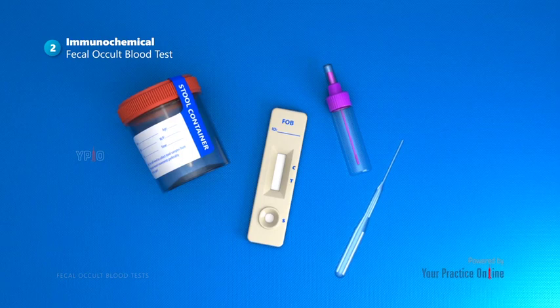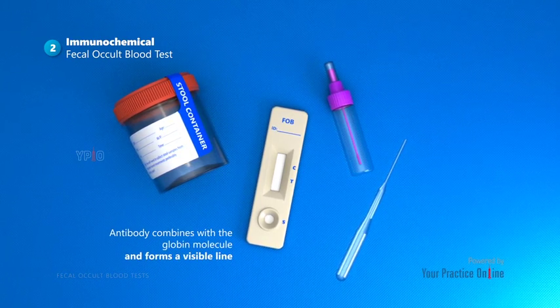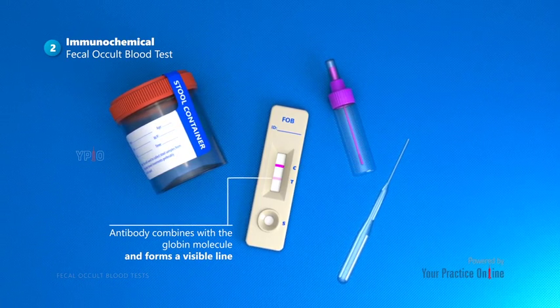Immunochemical fecal occult blood test. This test involves the use of an antibody that combines with the globin molecule in the blood and forms a visible line on a test strip.